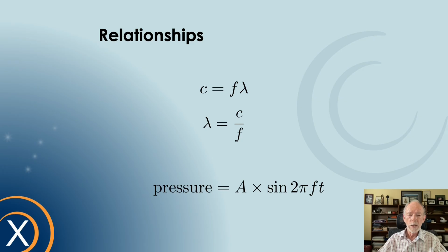For that reason, it's referred to as a sine wave. So the smooth oscillating waveform that I've shown you in the previous diagrams is referred to as a sine wave. Later we'll see that there are circumstances where the waveform changes in shape, and this then introduces harmonic frequencies which can be exploited in special ways that we'll talk about later.